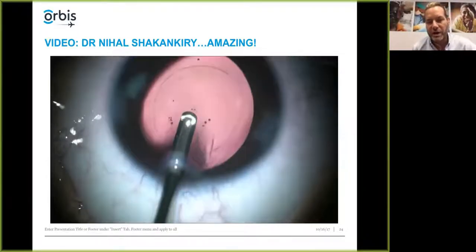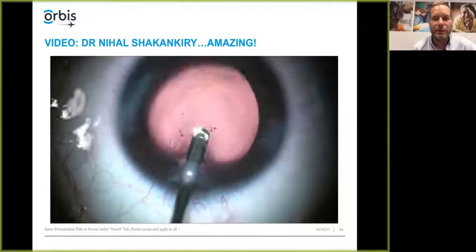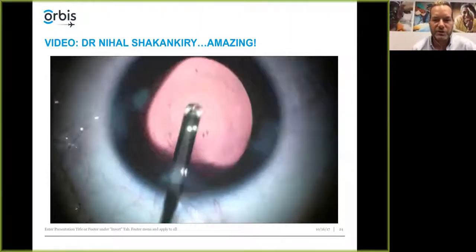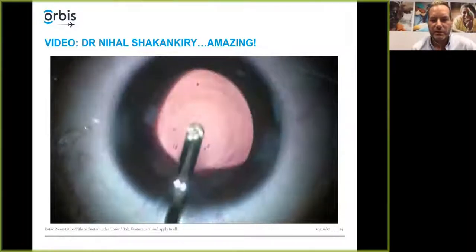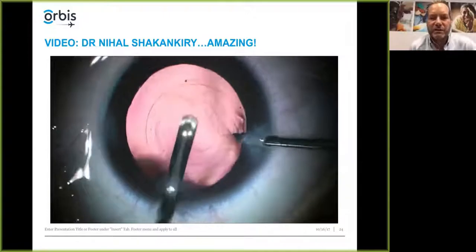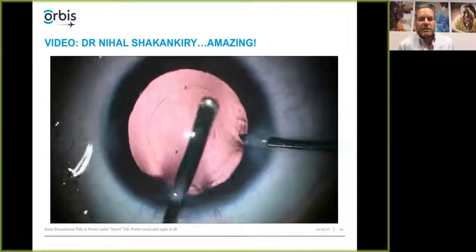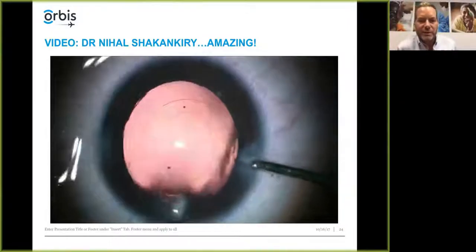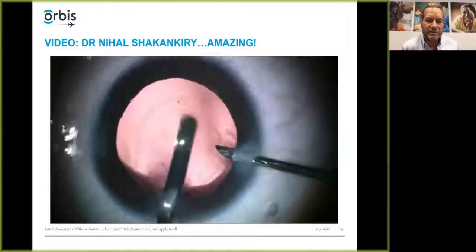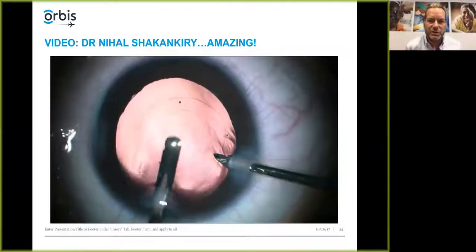She's doing it from the front, and those of us who are anterior segment surgeons mostly are more comfortable using a vitrector from the front. And you can see those lines, that's mostly the viscoelastic that she's in right now. But she's removing the vitreous face here so that there's not a scaffolding to support the migration of those lens epithelial cells. And once her vitrectomy is done, you don't have to do a lot of extensive vitrectomy.